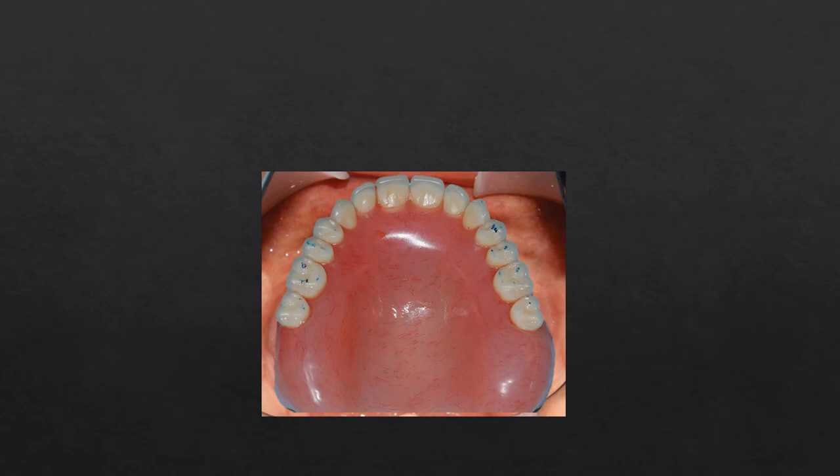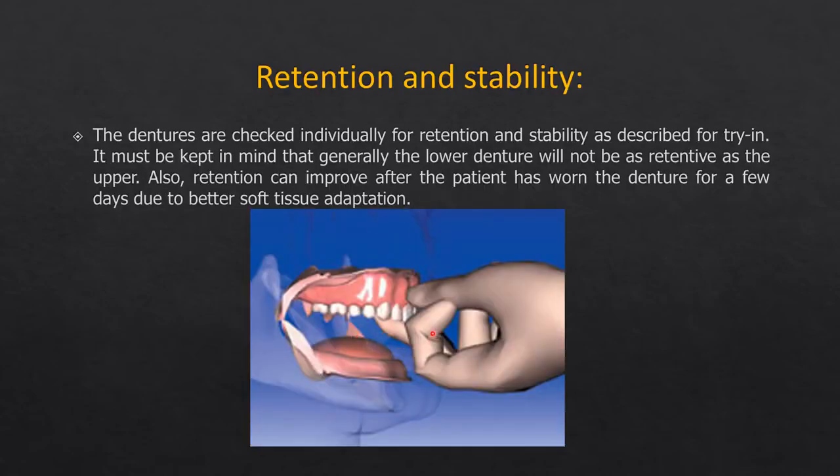Next, check for denture instability using a pinch method to pull the denture away from the denture-bearing area. You can also check contralateral border seal by placing a finger on the palatal aspect of the canine and pushing the denture outward. Don't panic if the denture is not fully retentive at insertion — within three to four days to a week, denture settling occurs as the residual alveolar ridge tissues mold to the internal surface, improving retention and stability.